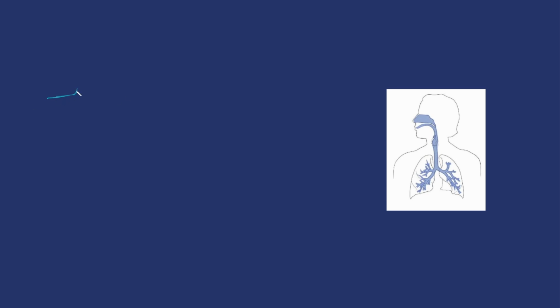We breathe in, we breathe out, it comes up, we get to our alveolar plateau, and then it goes down, and then that just kind of wash, rinse, repeat. Okay, like so. So that'll be like a normal wave.